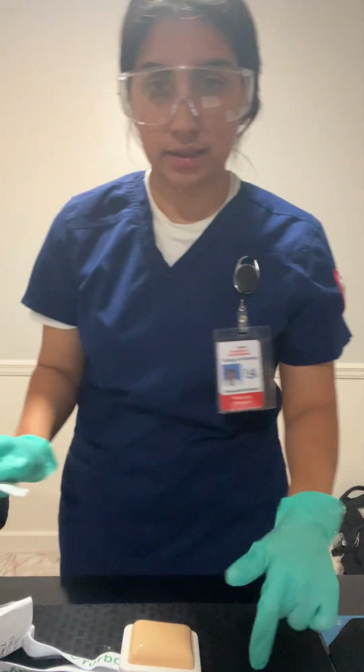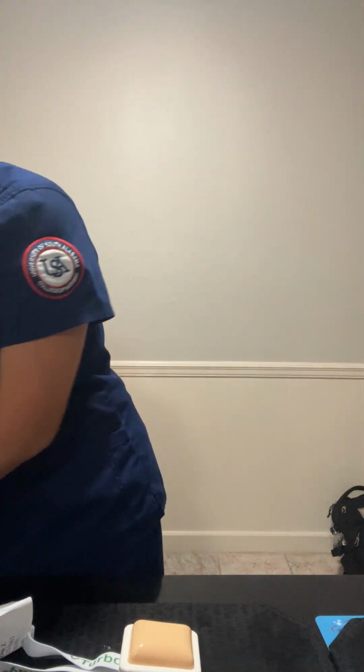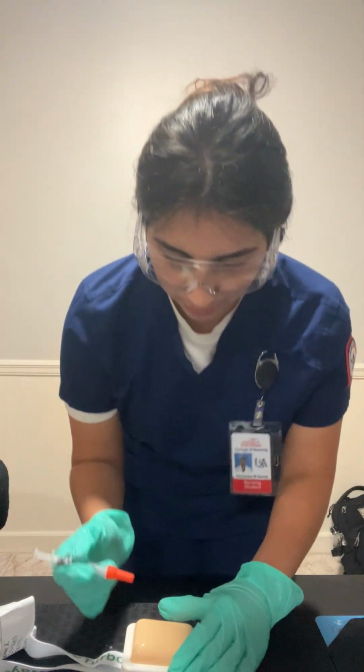And I'm going to clean the area in a circular motion. And I'm going to pinch.